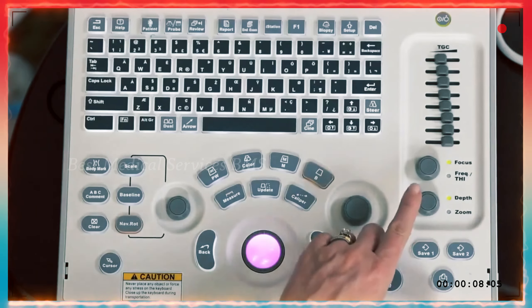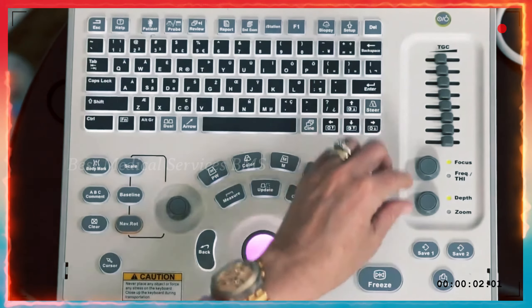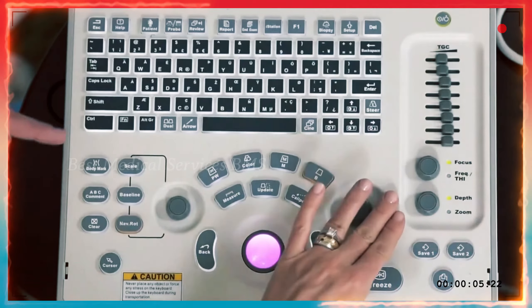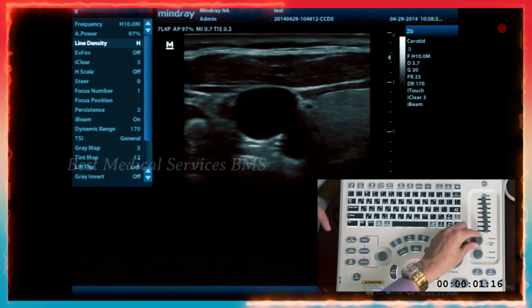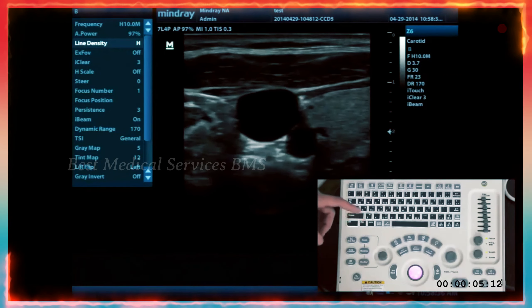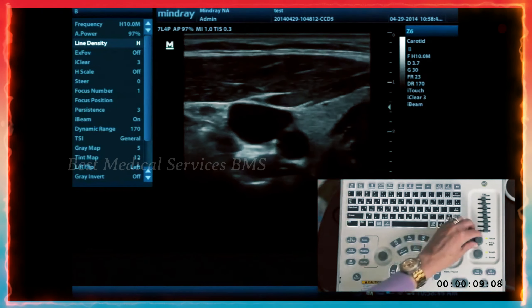To the right of the iTouch and gain, you have your TGCs as well as your focus, frequency, depth, and zoom. One knob controls your focus as well as your frequency, allowing you to jump in and out of harmonics. Where the green dot is next to focus, that means it's active. You can turn the knob and see that the focus moves up and down.